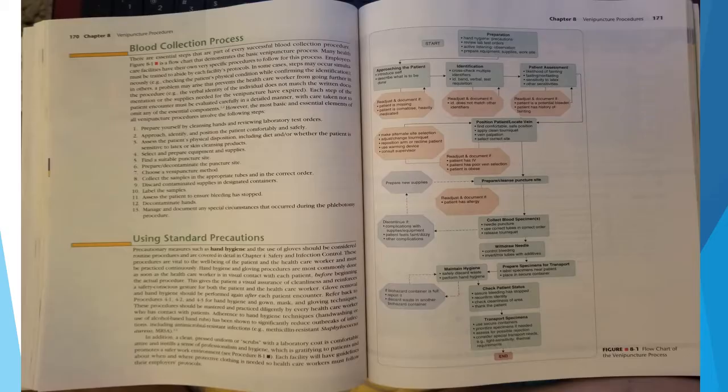Blood collection process. There are essential steps that are a part of every successful blood collection procedure. Figure 8.1 is a flow chart that demonstrates the basic venipuncture process. Many healthcare facilities have their own very specific procedures to follow for this process. Employees must be trained to abide by each facility's protocols.